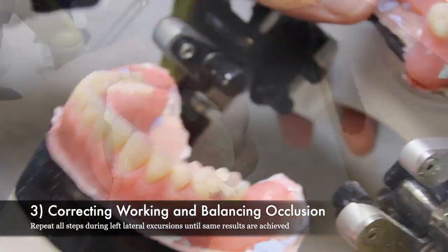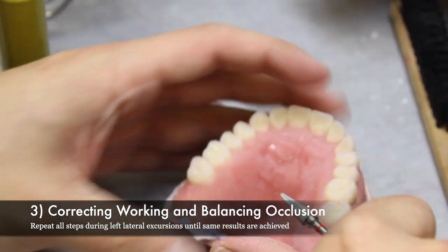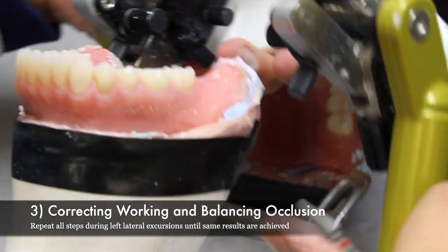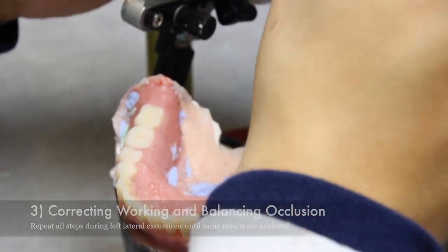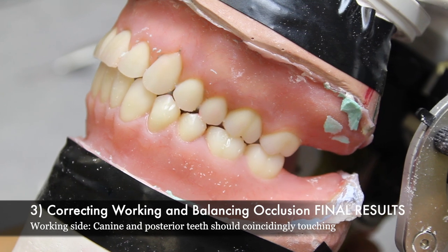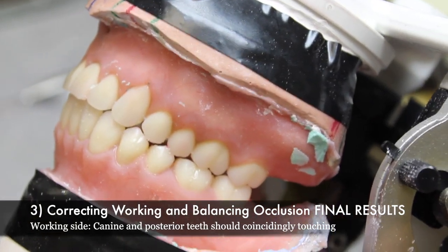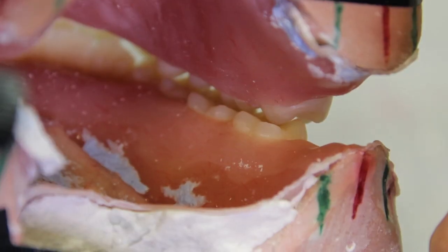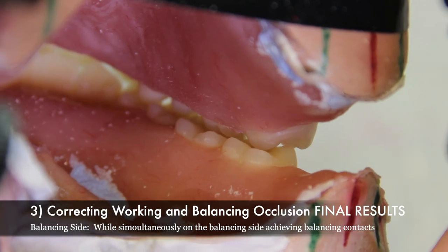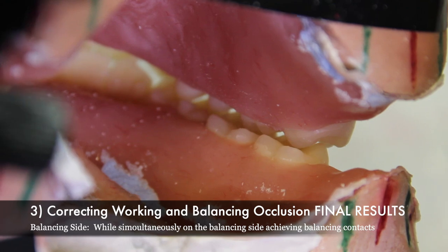Once the right lateral excursions have been achieved and working and balancing sides all have the proper contacts, repeat all the steps while performing the left lateral excursions until the same results are achieved. On the working side, you can see the canine and posterior teeth touching coincidingly, while simultaneously on the balancing side, you can see the maxillary lingual inclines of the lingual cusps riding the buccal inclines of the mandibular buccal cusps, creating balance and contact.